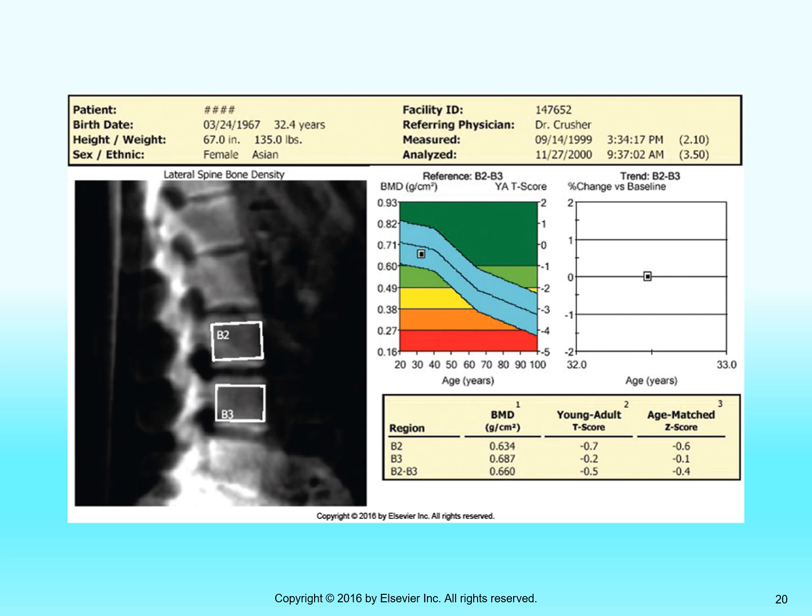And you can see in the color chart there, this is bone density in grams per centimeter squared. And the black square is where the patient has measured today. And then the slate blue, kind of grayish blue, I guess, that's what I call it, that's like the human being average.